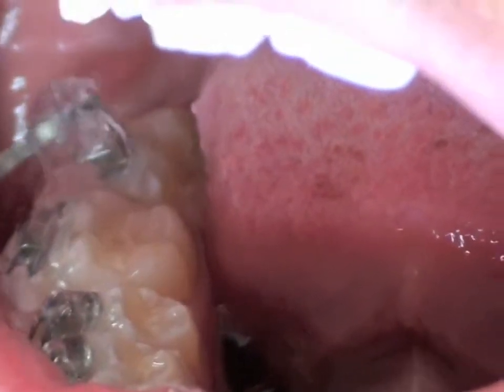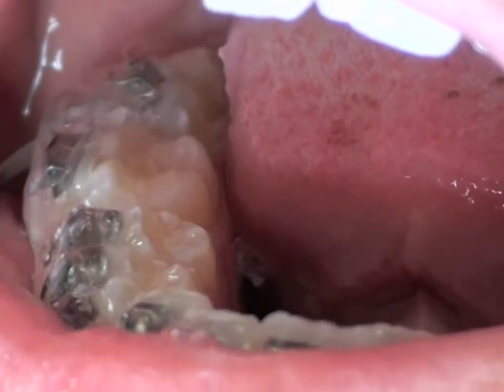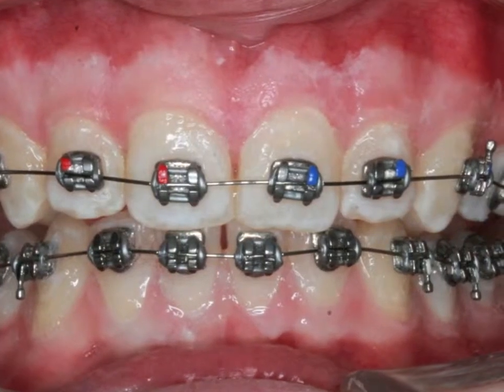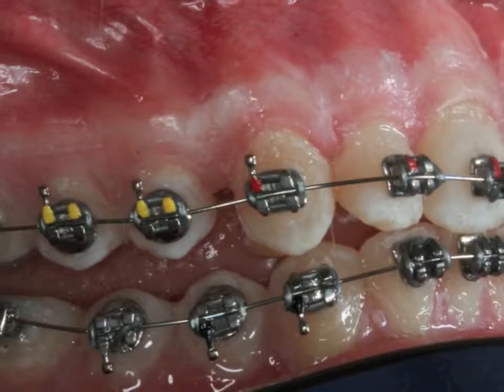Additional curing increases early bond strength after the outer tray is removed. After arch wires are replaced, bite bonders can be added to the anterior or posterior teeth depending on the depth of bite.